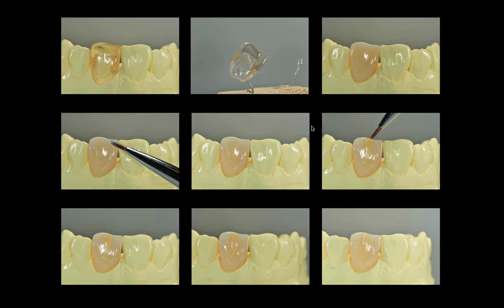And you say, why do you do this? It's a very simple answer, and I got that answer through window glass. If you take some kind of rough instrument and you scratch your window, you'll see white scratches everywhere. Now, if you put enough scratches, that whole window looks white. Same thing when you grind this glass. When you grind, you get scratches, so the crown looks white.